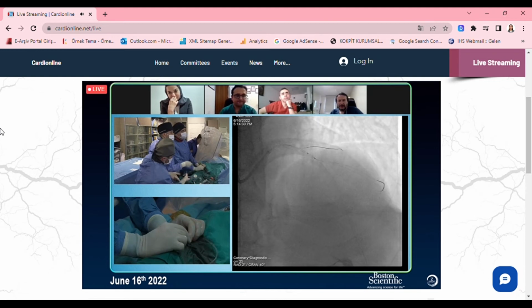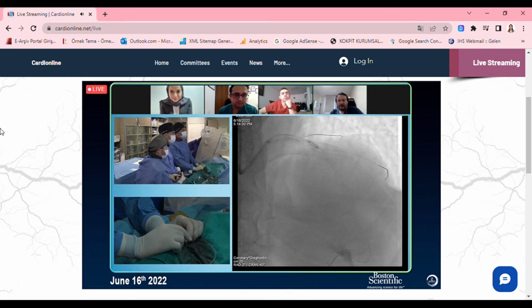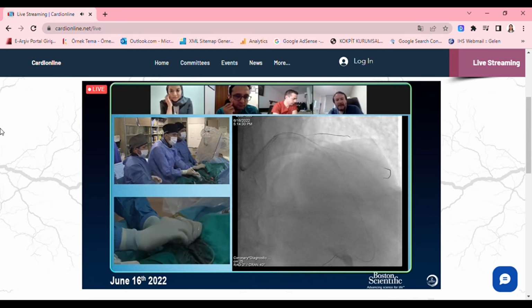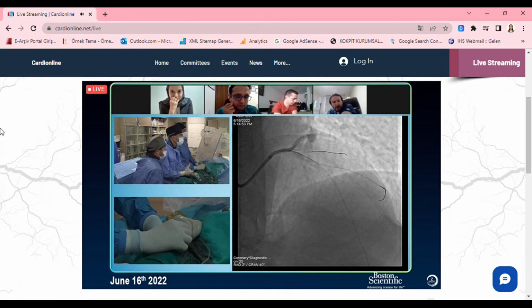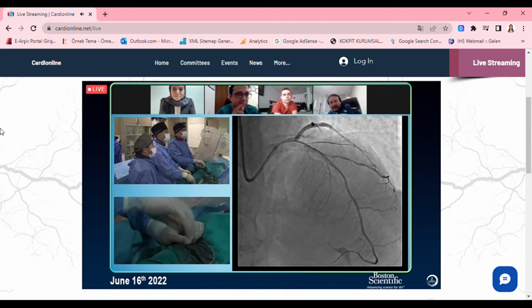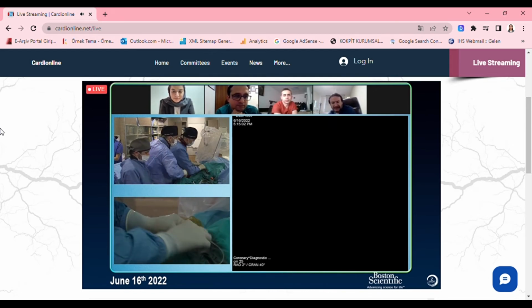Yeah, we need to have pain. The IVL option is always off the table. Okay, let's see. I think it's okay now. I think you should do more proximal also. You see the proximal part? Yes, it needs modification also. But you see, I'm losing the diagonal.